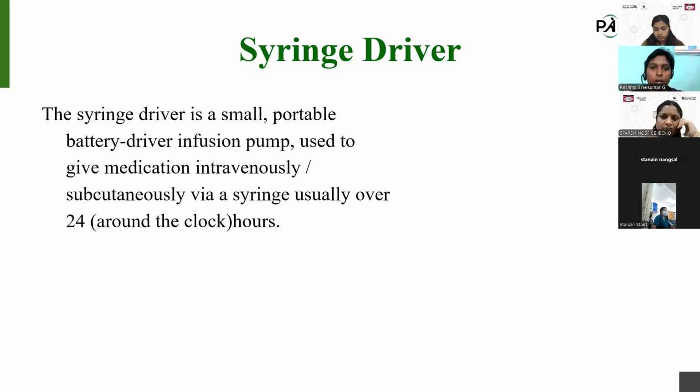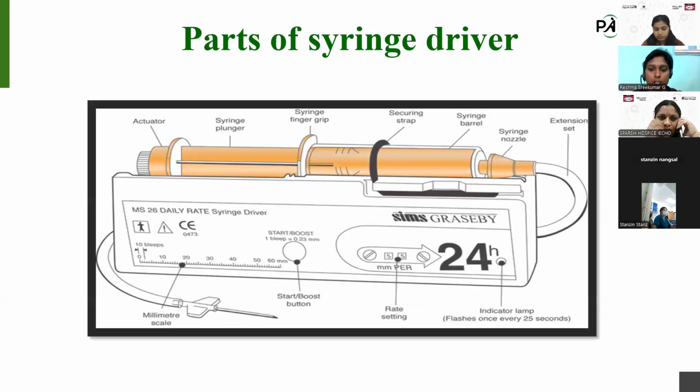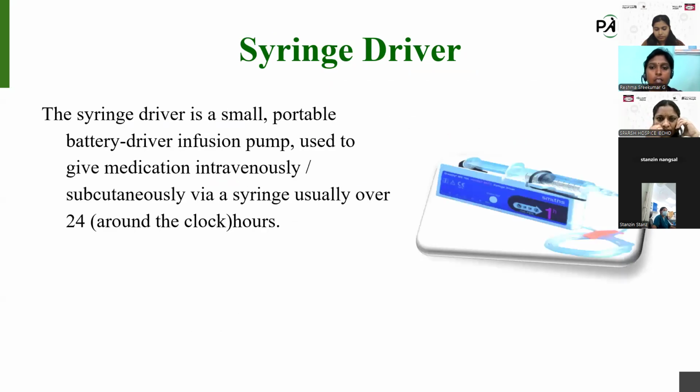And these are the syringe drivers we are using here at Palliative for giving subcutaneous infusions. In this, if the patient is at end of life, we can give palliative sedation through these syringe drivers. We are usually giving morphine, fentanyl, haloperidol, midazolam, all through these subcutaneous syringe drivers.